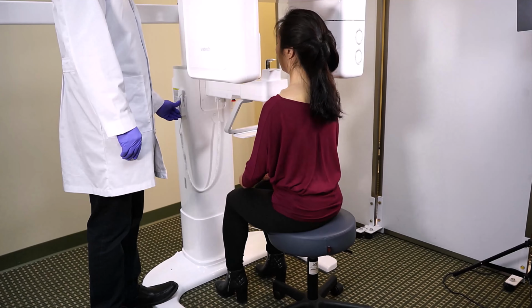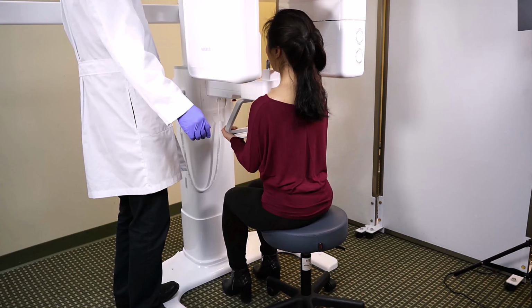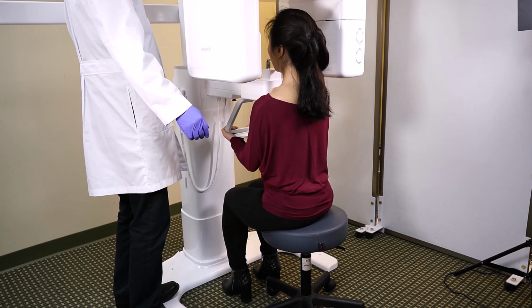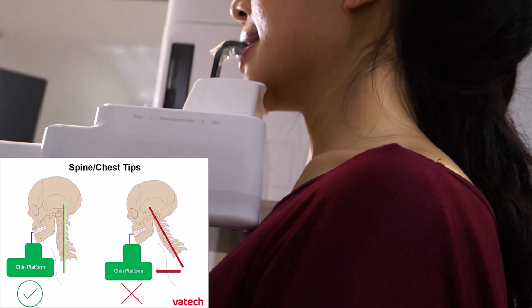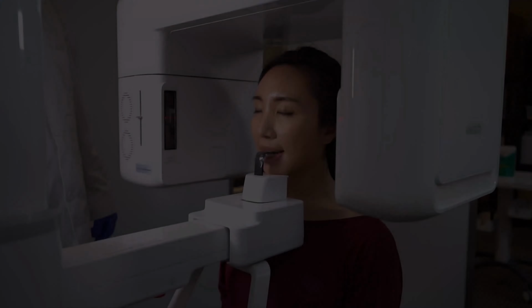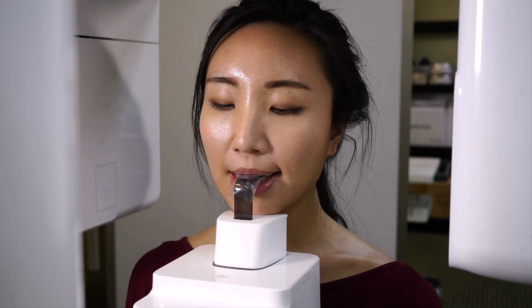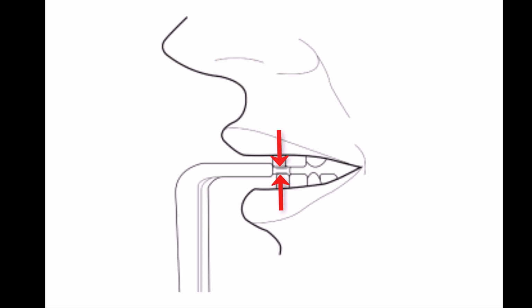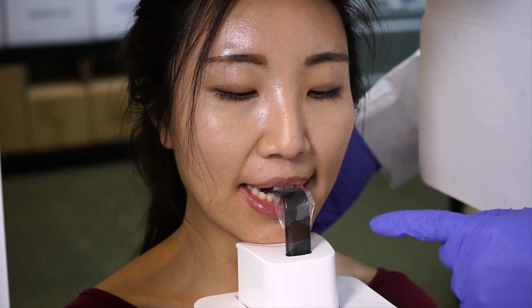As you have the patient roll into the machine, have them hold the handrails with their palms facing up. Keep the feet at shoulder width apart for stability. Ideally, we want the patient's spine to be as upright as possible and the chest close to the device during image acquisition. With a clean vinyl bite stick cover, have the patient bite on the bite stick firmly in place. Ensure the teeth are firmly in the grooves. As a tip, pull down on the bite stick to secure the patient.